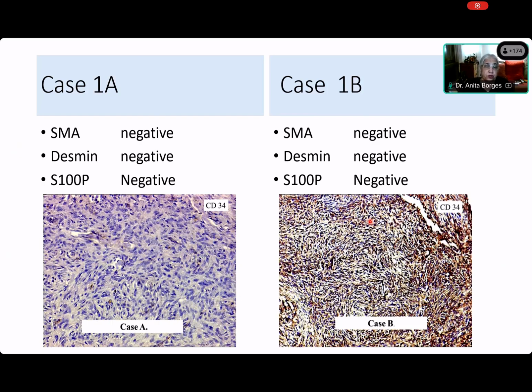You have to resort to immunohistochemistry. You can make a guess, and some of you have made a guess, and I call those an educated guess. Something that is very cellular, you are unlikely to want to call a benign lesion. But this is not something that you should take your chances on. This is something where you need to do immunohistochemistry.